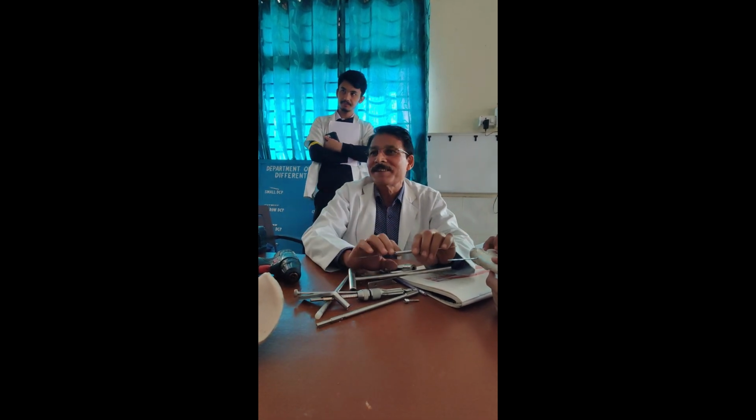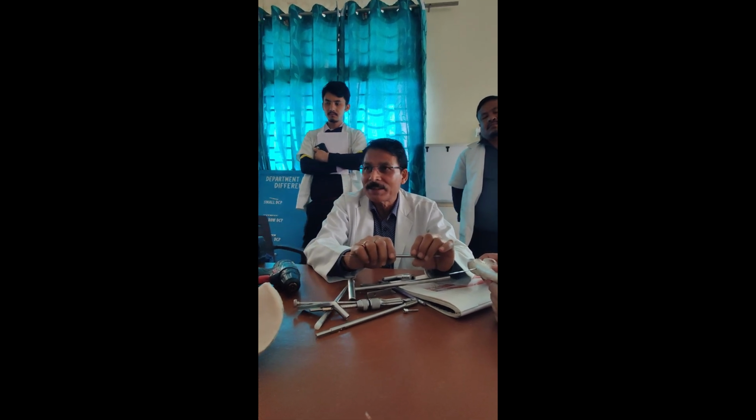So you will find that finally it is locked, and you are going to tighten it more. Instead of the screw propagating, the whole fragment may rotate. So you may take the help of bone holding or something else to counter it. Sometimes hold it and then it goes inside. Or otherwise you have to reverse it back one thread to make it horizontal.